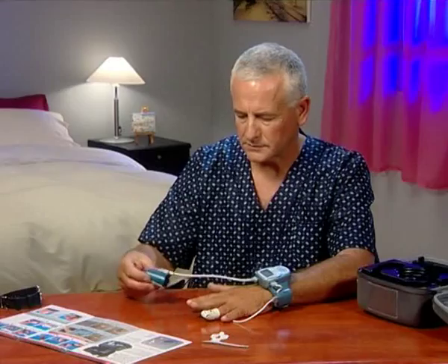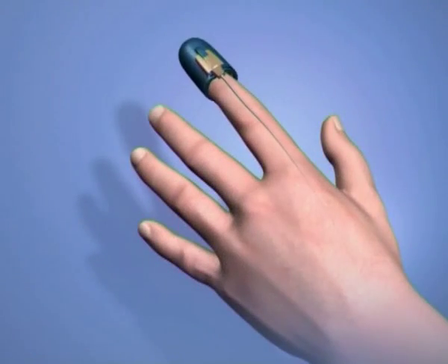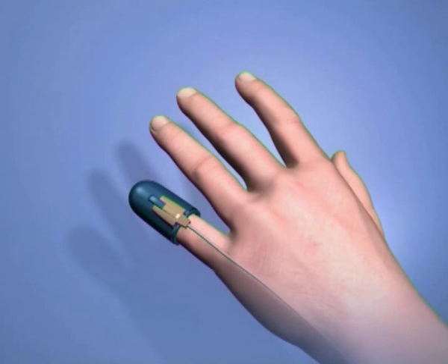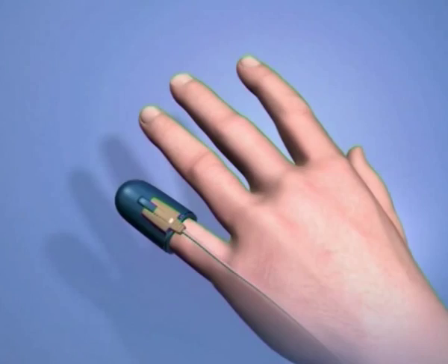Now, place the PAT probe on your index finger. If your index finger is too thick for the PAT probe, you can choose another finger that fits better — for example, your pinky. Choose carefully, as once in place, the PAT probe cannot be removed and placed on a different finger.